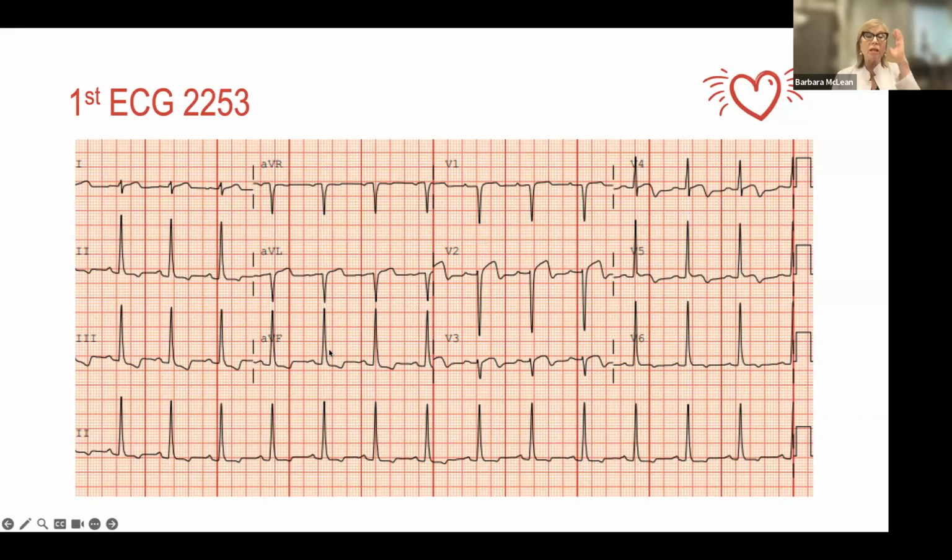So one of the first things I'm going to think about looking at this EKG is, is it possible the patient has a pulmonary embolism? Another thing that's really important with PE, there's a lot of things we look at on EKG for PE, but we also look at a coving of the PR interval, which you actually see here. And normally I would look at lead 2 and V1, looking for that coving. It's not really present in V1, but I've got a little cove of the PR segment here, and I have it in lead 3. I have it in some of the chest leads as well. So I'm now kind of increasing my concern that he might have a PE. I'm going to be thinking about that in the way that I'm going to evaluate and what I'm going to rule out for the patient. Does he have a PE?